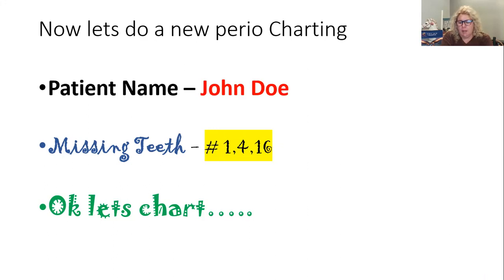You should have said mid or middle buccal of 14. 3, 3, 3, 4, 4. So now we should be finished with the buccal maxillary arch. Now we're going to come around. So we just finished over here with the numbers. Now we're going to drop down and we're going to work our way back across.